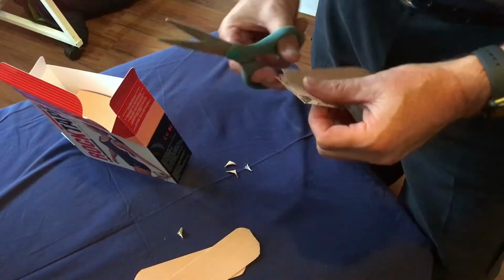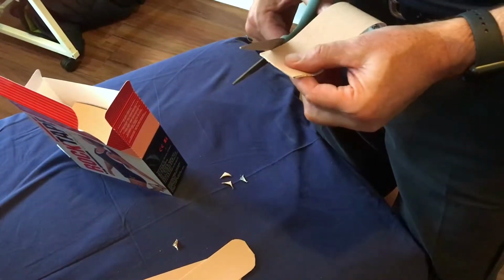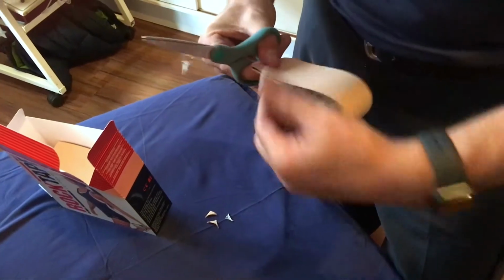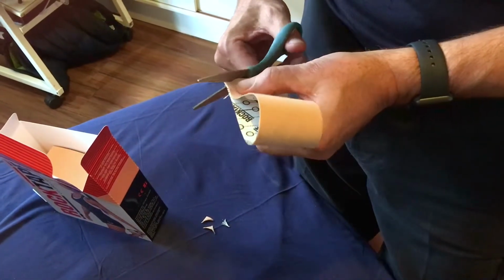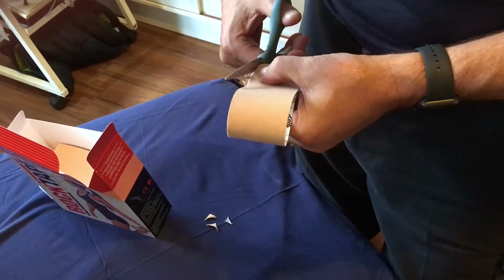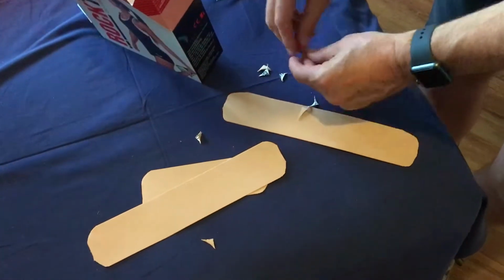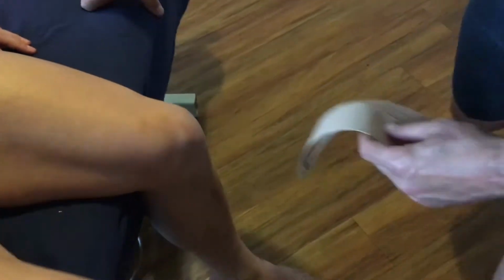So we basically cut off, I double it over and do 2 at once. Try not to have any sort of loose threads or edges. Doesn't have to be really precise, but essentially having rounded corners. So just got Lockie here. We're going to take Lockie's knee on the left hand side here.